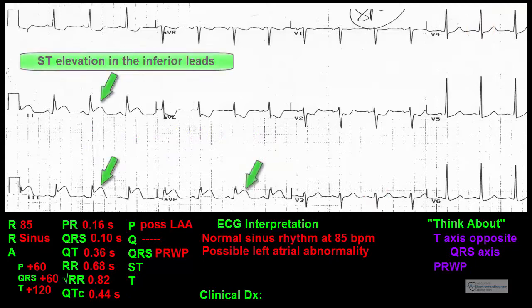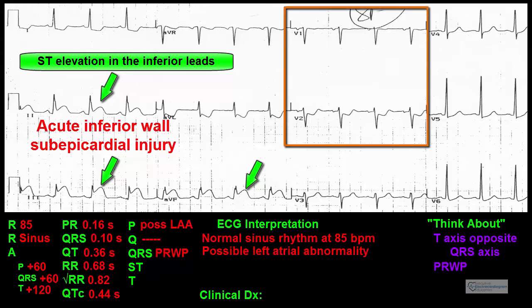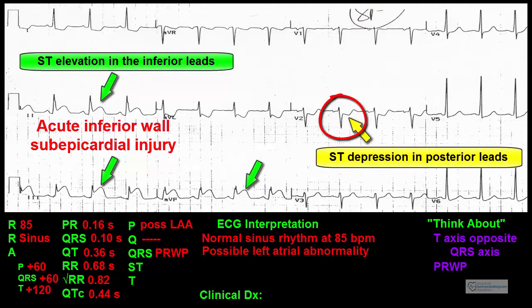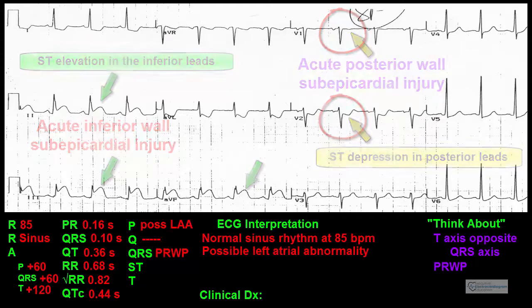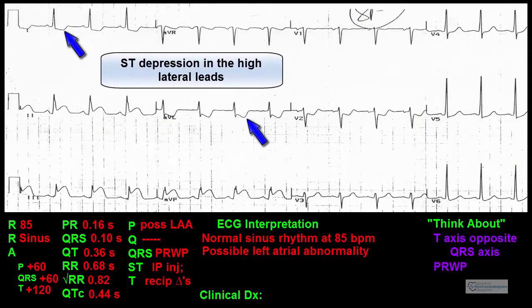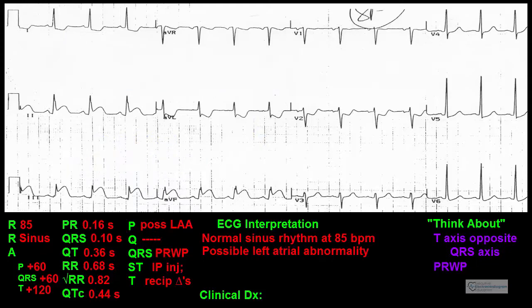ST segments: The ST segments are elevated in leads 2, 3, and AVF, suggesting acute inferior subepicardial injury. Since the inferior wall is involved, we should look for posterior wall involvement — and in fact, there is significant ST segment depression in lead V2 and subtle ST segment changes in lead V1, suggesting acute posterior wall subepicardial injury. In addition, there is ST segment depression in leads 1 and AVL, consistent with high lateral reciprocal changes. The ST segments in the remaining leads are at baseline and normal.